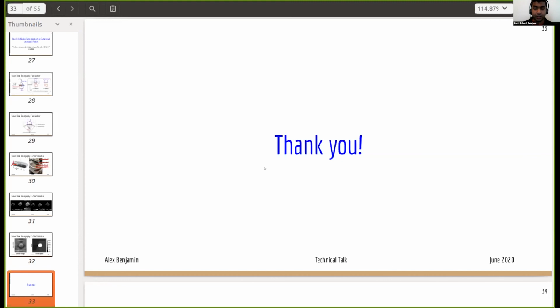We were able to actually scan volunteers. The good thing is that with the existing framework, the scans themselves take under 5 minutes. The bad thing is that in reality, all of these organs are deformable, and all of these organs move from time point to time point. In order to restrict patient motion, you have to ask them to hold their breath, which is less than ideal. So some of the major challenges that would need to be addressed: one is to account for the deformation of the organ, two is to robustly account for patient motion, and three, which I think is the bottleneck in this current step, is developing automated methods for segmenting out the organs so that volumes can be quickly reconstructed.